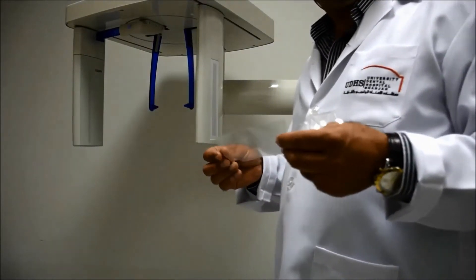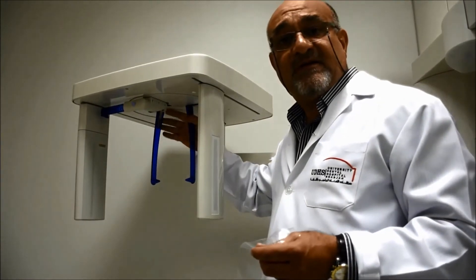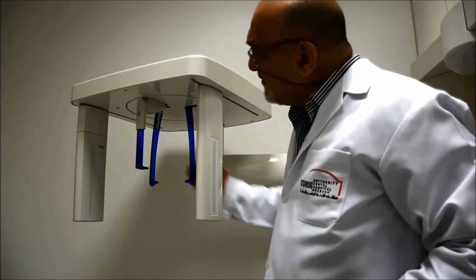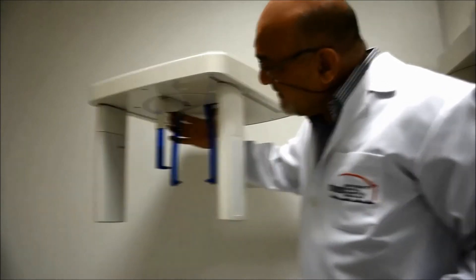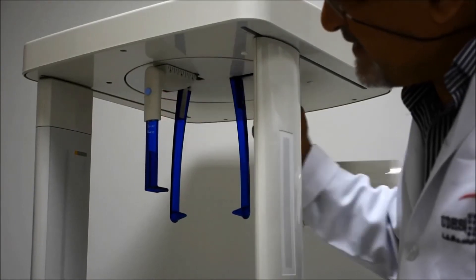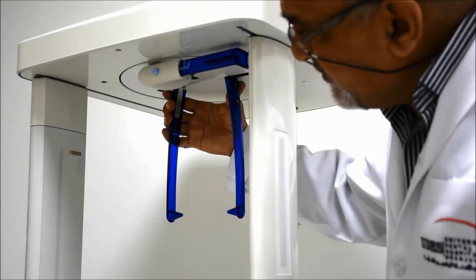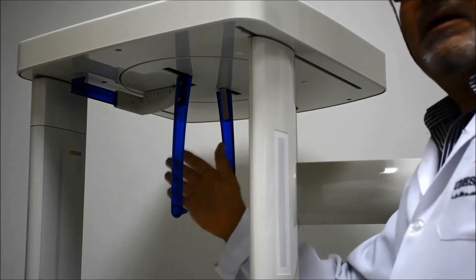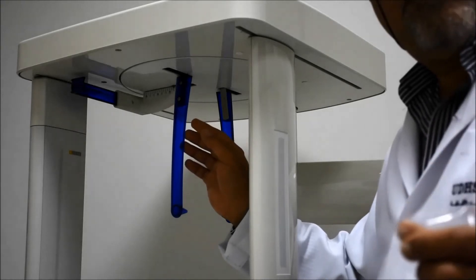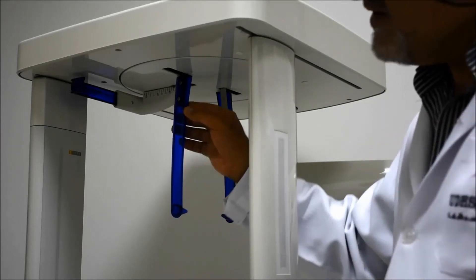In the lateral ceph position, you have the cephalostat. The cephalostat can move in different directions. This is the frontal stop. If you need a PA ceph, you move the frontal stop away and rotate the patient. For the wrist exposure the position is similar, but we'll stay focused on the lateral ceph.